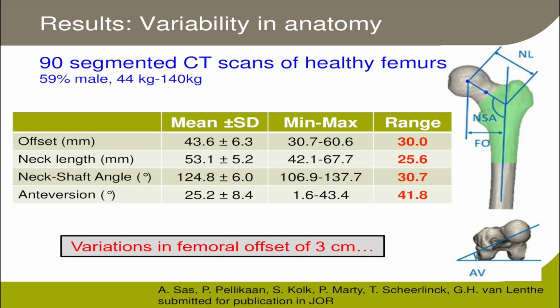And then we tried to virtually implant in these segmented femurs an Optimys stem, trying to have the maximum calcar-guided implantation, but also taking care that we maximized the cortical contact, because we believe that that was important for implant stability. And we might be criticized for that. I know other people want to implant them with less cortical contact, but we put that really as a priority. And as such, a lot of our stems might be implanted larger than some of you might implant your own Optimys stems.